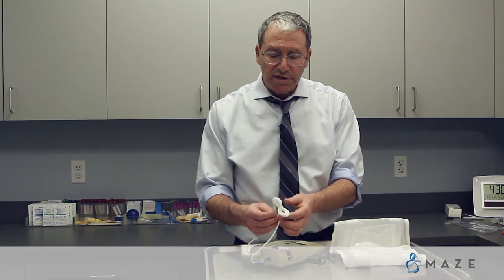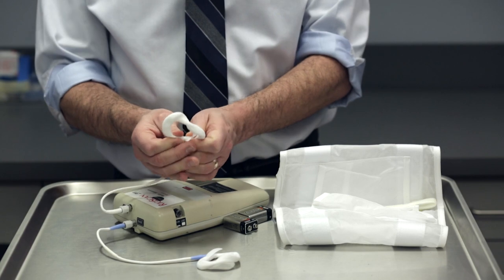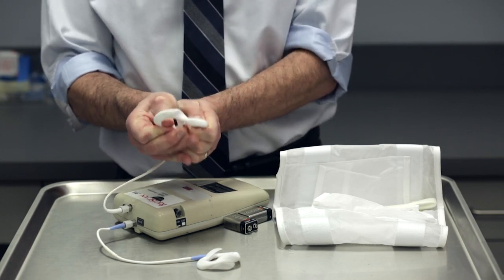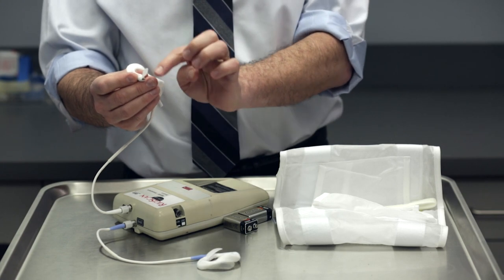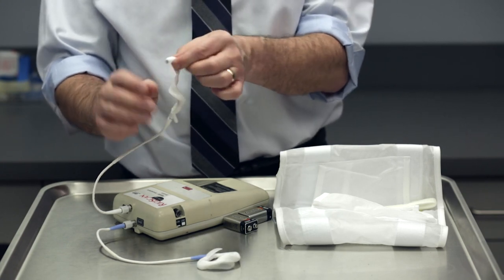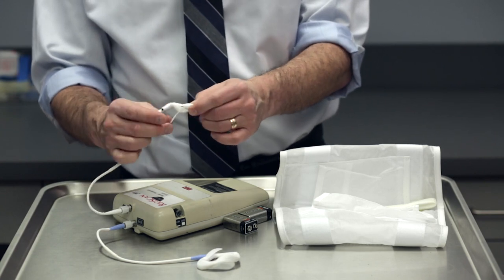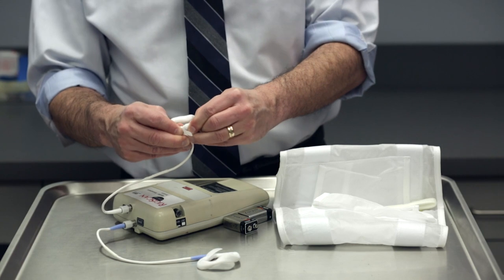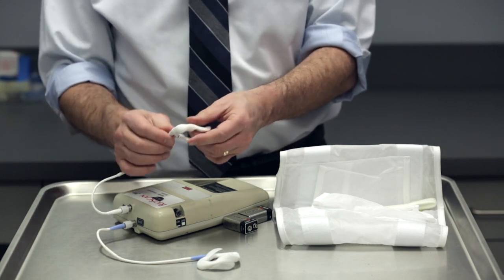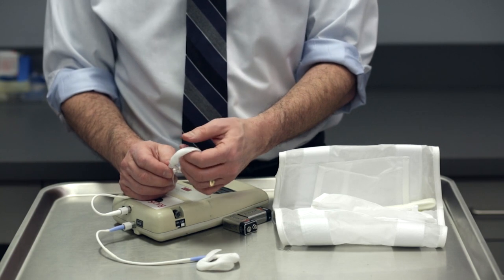One of the most common problems is that you wake up in the morning and the loop has popped. The way this works is there is a wire gauge that goes through a disposable sheath, and this gets plugged in to the port, completing the loop. It has an automatic pop-off system — the purpose is so that you don't guillotine your penis.